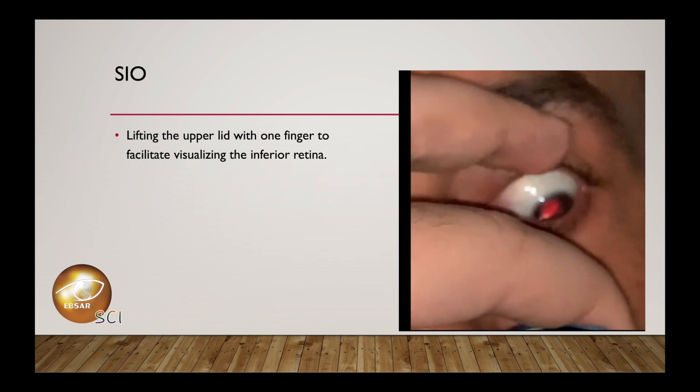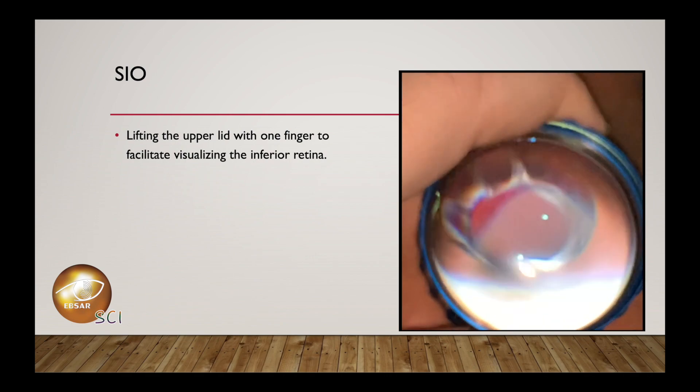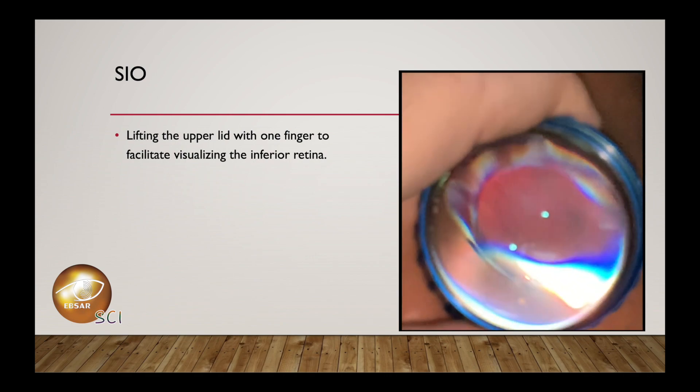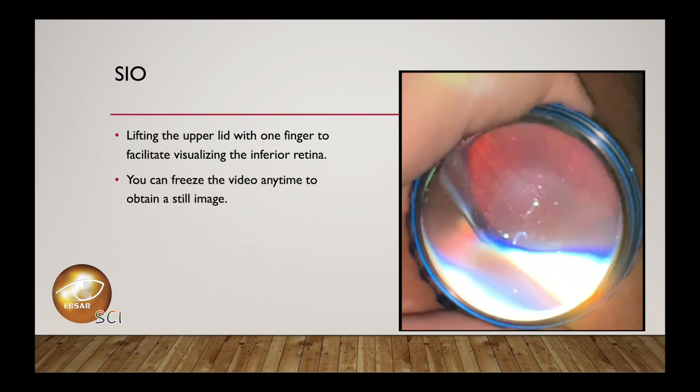Now lifting the upper lid with one finger to facilitate visualizing the inferior retina. You can freeze the video anytime to obtain a still image.